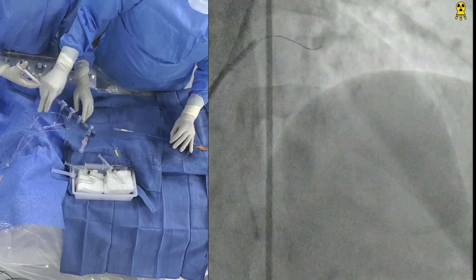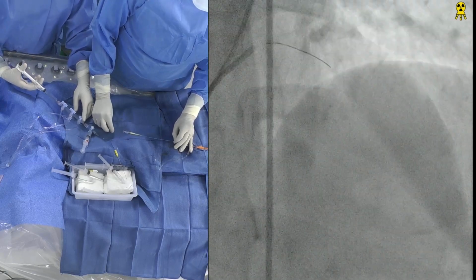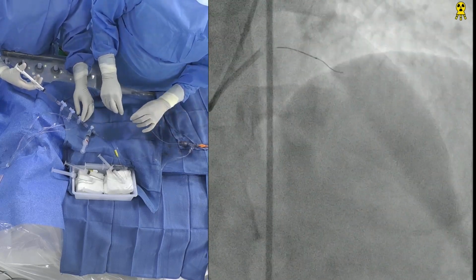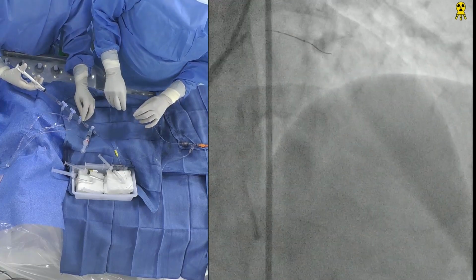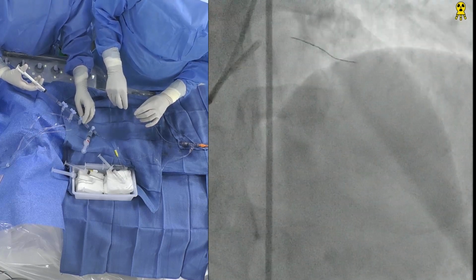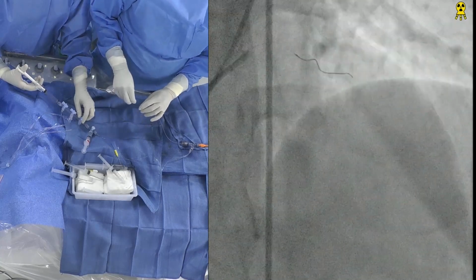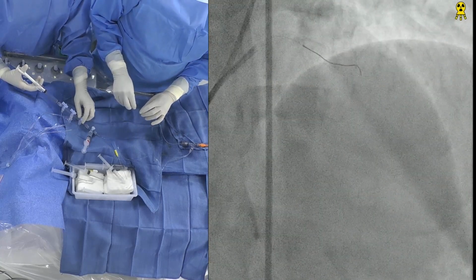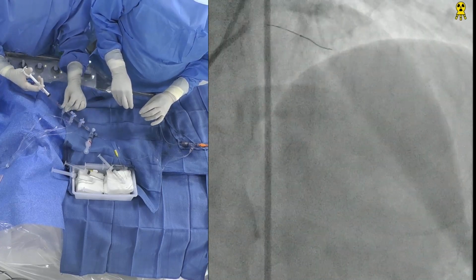So, I mean, there is an important discussion here. I have noticed this, of course, as your practice. But today, for the first time, I have heard you articulate that the real purpose of your practice is post-procedural imaging evaluation. Correct? Yeah, absolutely, yes. Yeah, because I think that's basically it.